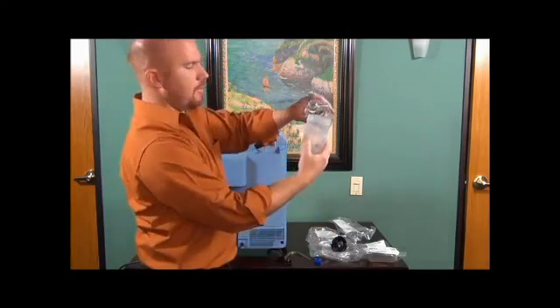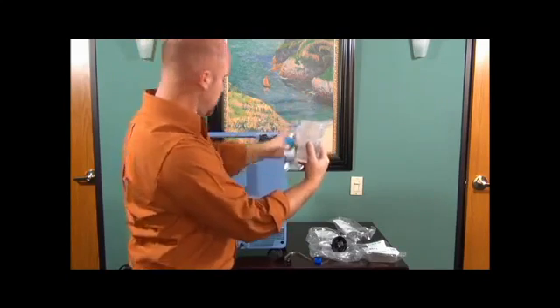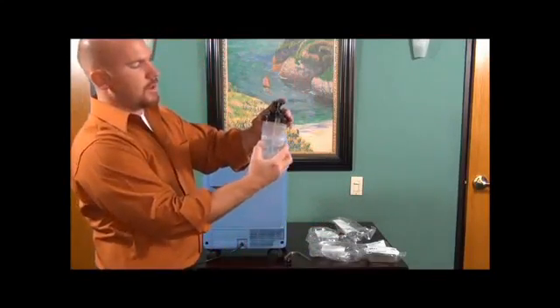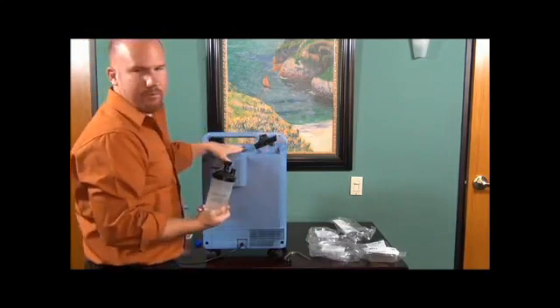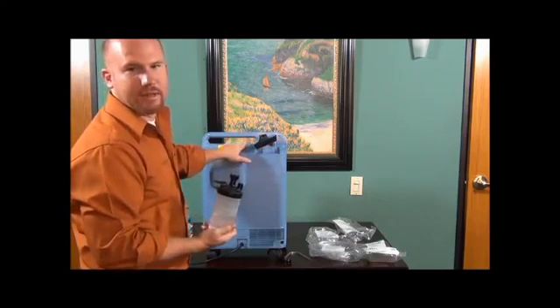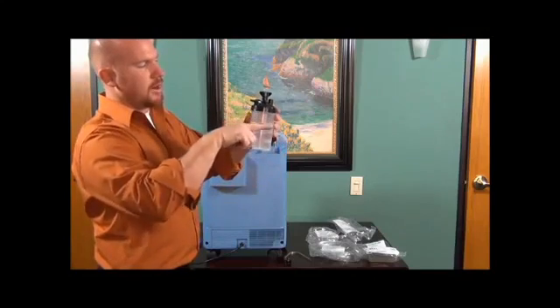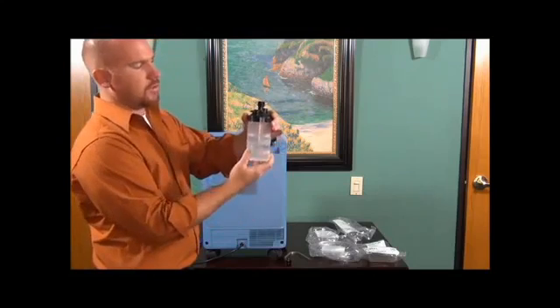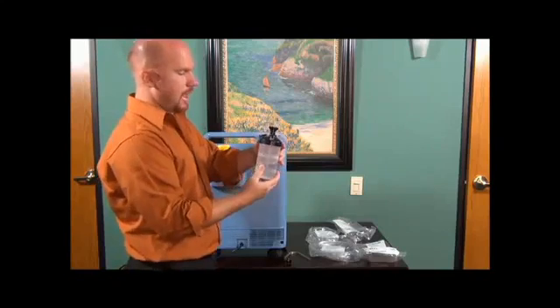Then you're just going to fill it up. I like to fill it up right in between the minimum and maximum lines. And then when you put your lid back on, you want to make sure that it's on nice and straight. A lot of times you'll get an error message, or an alarm will go off on your concentrator if this is not sealed properly, because a lot of air will leak out here, causing backup to happen in here, and it'll go off. So a lot of times you want to make sure that's on straight, and that could solve a lot of the problems you might be experiencing.